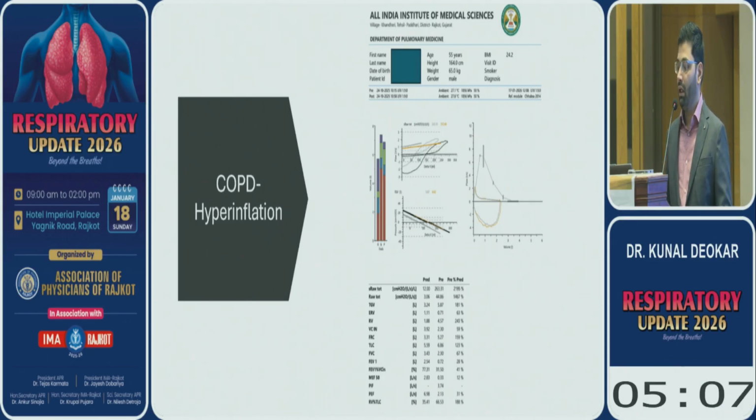And then in such cases, you can even use total lung capacity to monitor for treatment. Like in some patients of COPD, you start bronchodilator therapy. There may not be any change in FEV1 or FVC post-treatment. But if you do their body plethysmography, you see that the TLC has reduced, RV has reduced post-treatment, suggesting improvement, suggesting that now hyperinflation or air trapping has decreased or resolved.